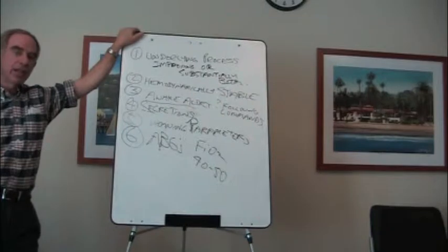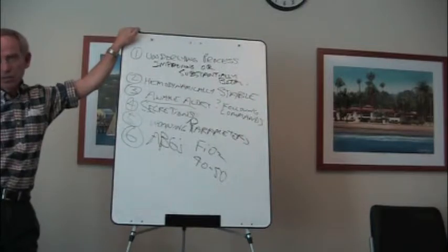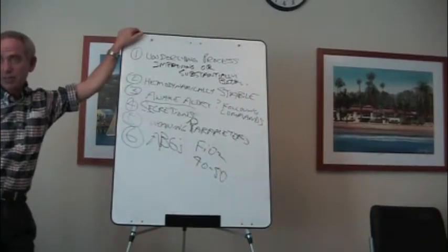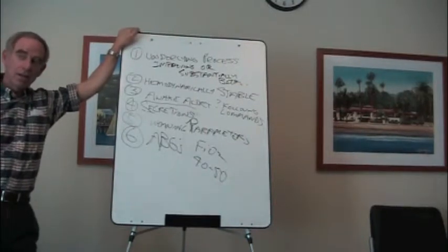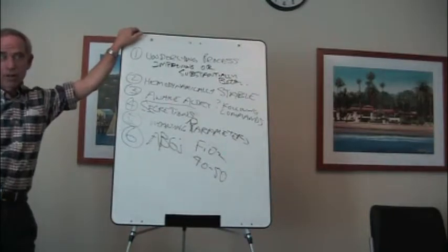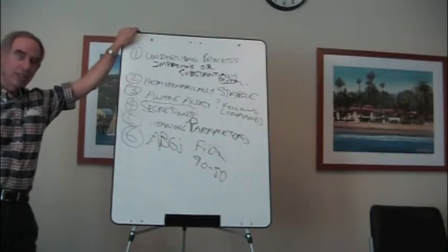Well, it gets down to, yes, you can supply oxygen at higher FiO2s than 50%, but the amount of reserve you have at that point, you don't have a lot of room to negotiate. If you start at 70, maybe you can get up to 80% on non-invasive masks or Vapotherm or non-invasive ventilation. Maybe you can even get up to 90 or 100%. But there's not a lot of reserve there. And generally, once you take somebody off the ventilator, their FiO2 requirement usually goes up about 10% on average. So if they're on 40, they're probably going to need about 50 when they're off the ventilator. If they start at 70, they're going to need even more than that.